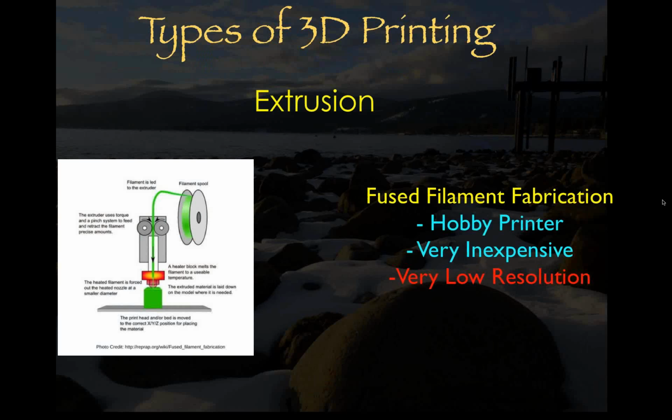And one other quick tip: if the diagnostic case requires prepping of the teeth, then what I do is scan the model first as a pre-prep, stop, go do my preparations, then come back and scan that as a working model so that I can fade in my pre-op and see where the teeth were before I prepped them. And that's really quite helpful. So anyway, enough of that. And if you want to dig into this deeper, we can, on how to specifically reuse these diagnostics and other things associated with that.